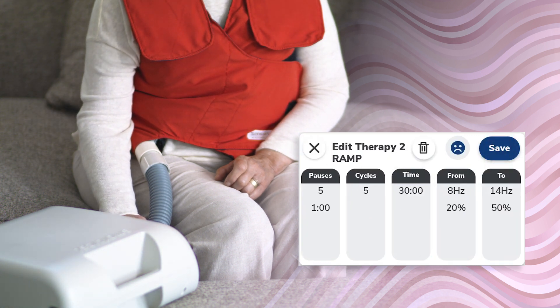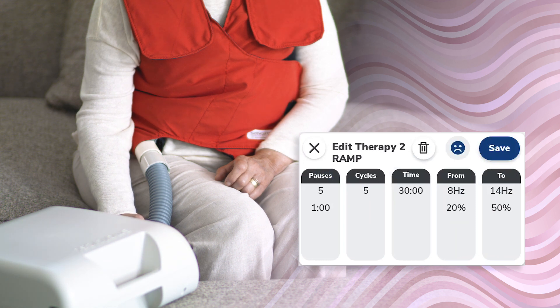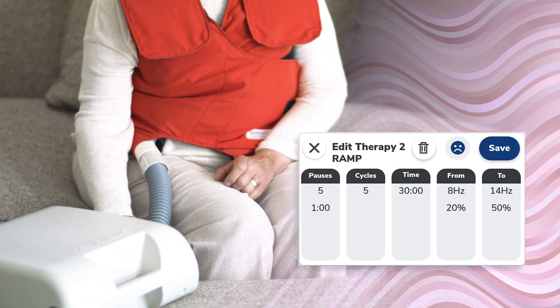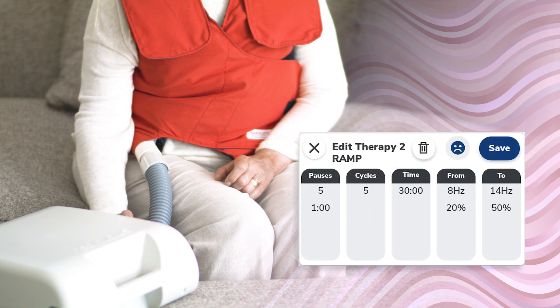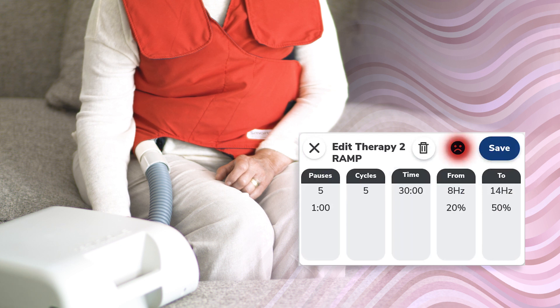From the edit therapy screen for ramp therapies, changes can be made to the pause, cycles, time, from, and to settings by tapping anywhere on the gray box. Changes can also be made to the therapy's label by tapping on the label icon.